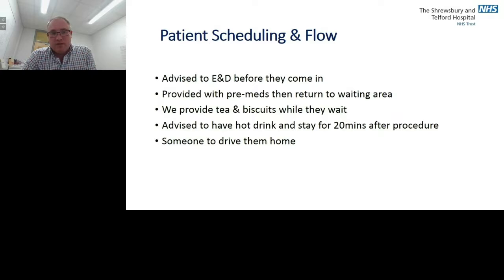We do advise that the patients have someone drive them home following the procedure, purely because we offer Oromorph during the procedure or prior to the procedure, and this can make some of them a little drowsy.